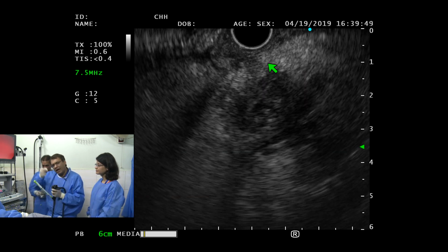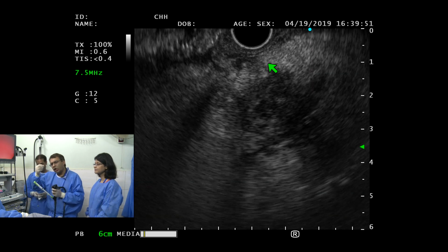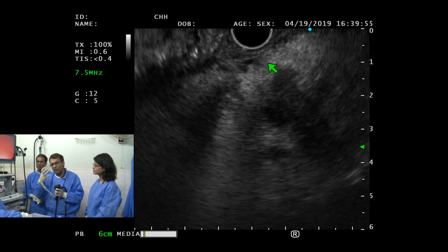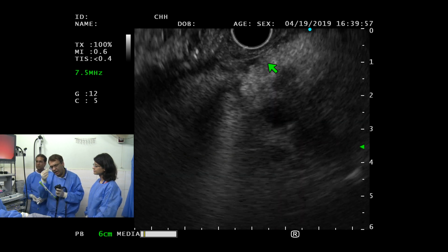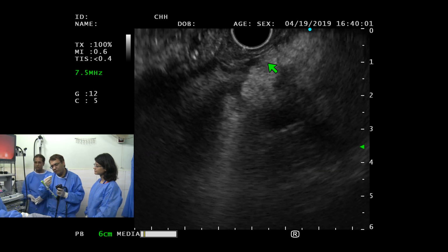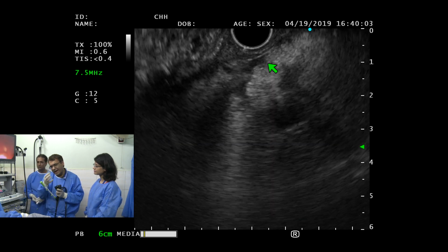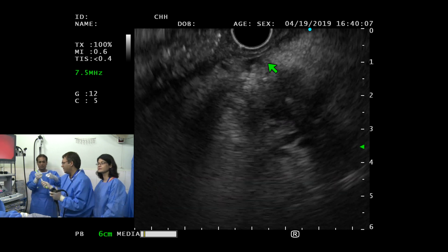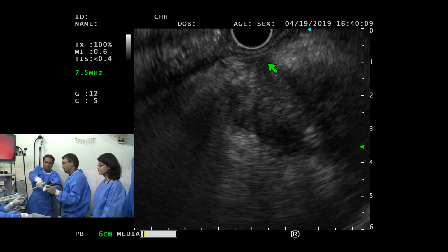I can feel what I got in there. So with the core needle, you have this tactile sensation. When the tissue gets in there, it's not a very smooth movement, the feel you get. It's a little bit crackly. I don't know what would be the best way. Crackling a little bit, I should say.